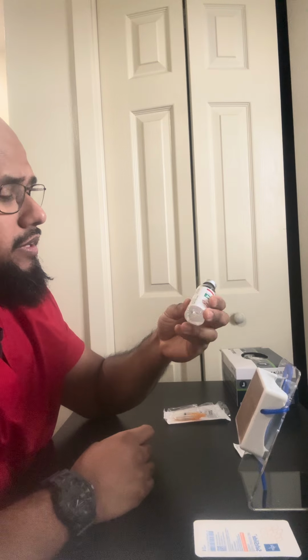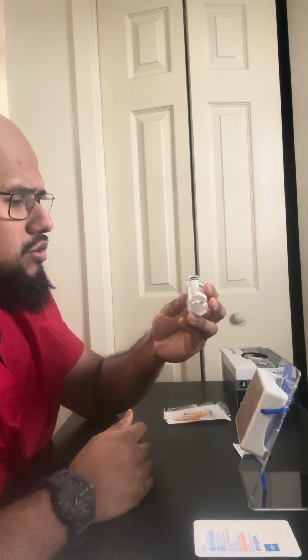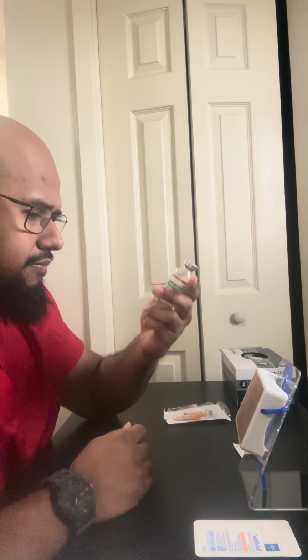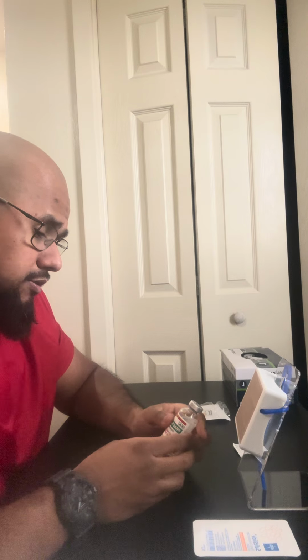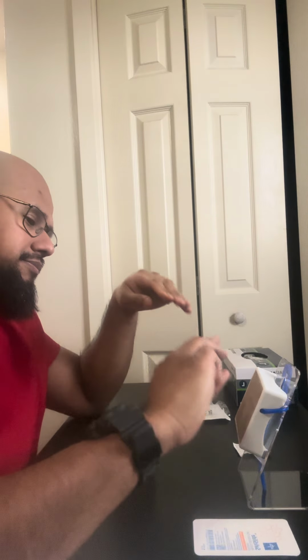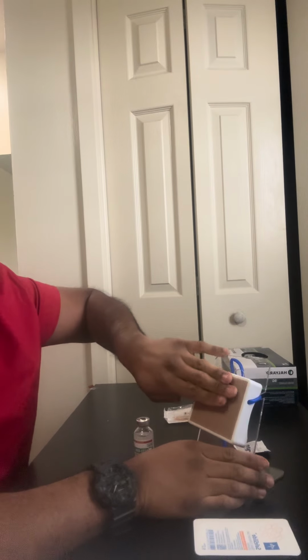Any time you give medications through a vial, just check the expiration date. Okay, this one is not expired. All right, Mr. Jones, we're going to give it in your deltoid, okay? Patient agreed. Your deltoid is pretty much where your shoulder is, and three fingers down. Let me see if I can explain it. Here's his shoulder.